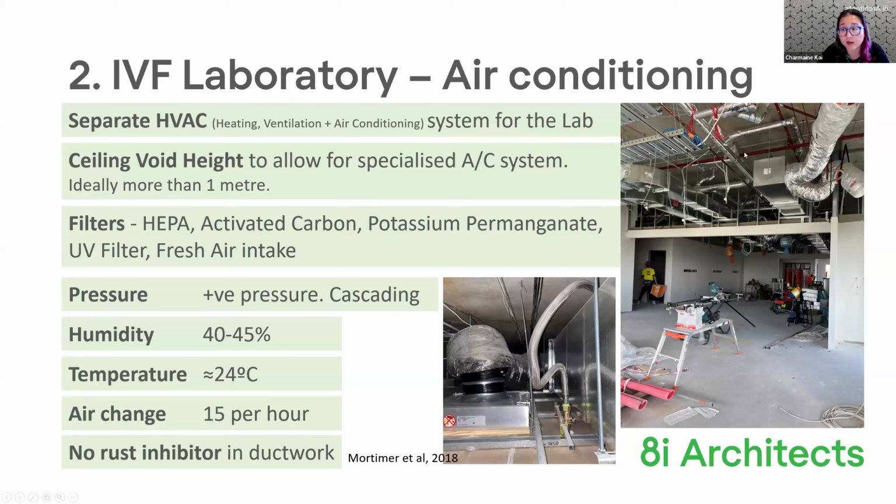We have electrical cables. We have fire services, so fire sprinklers. And then we'll have flexible ducts within the space. But as you can see, there isn't a lot of space left after all these services go in. So the more space you can get, the better. And in this photo here, you can see this is about 600 millimeters, so just over 0.5 meter in height. And you can see on the right, that's actually an air conditioning duct. There is probably only about 2 inches of space above it. So it's really tight, and that's sitting right on top of the ceiling.